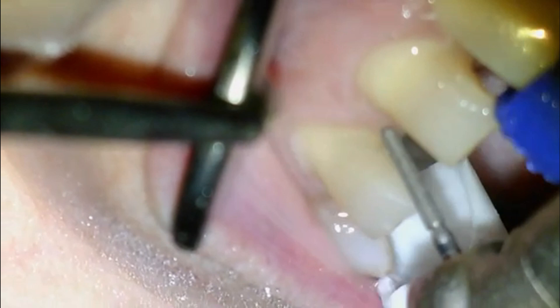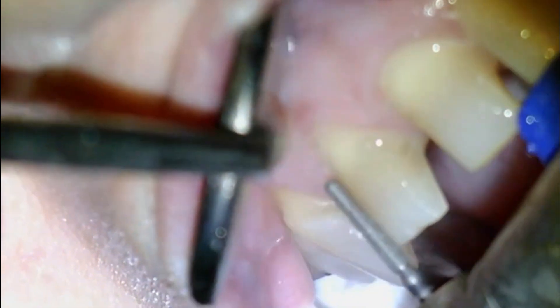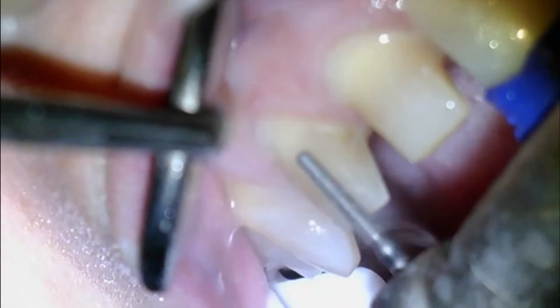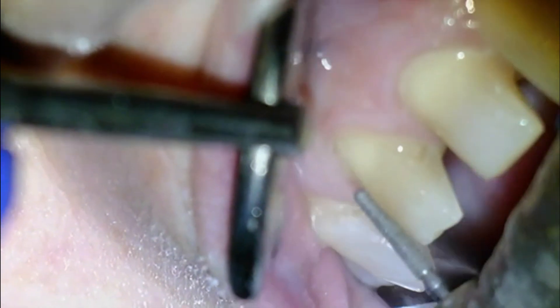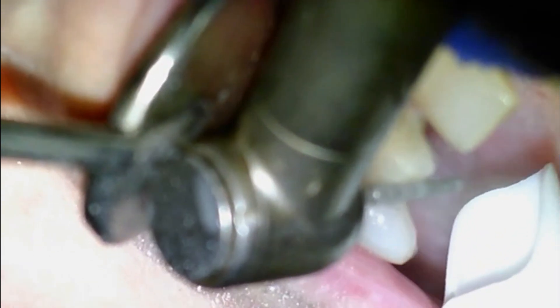This is kind of what I see with these patients — usually the back molars are very eroded and the backs of the top front teeth are very eroded. This is a very common presentation with patients that suffer from GERD, really bad acid reflux, purging, bulimic patients, or things like that. So what I'm doing here is planing these front teeth. I do three planes on the buccal or labial portion of my anteriors.